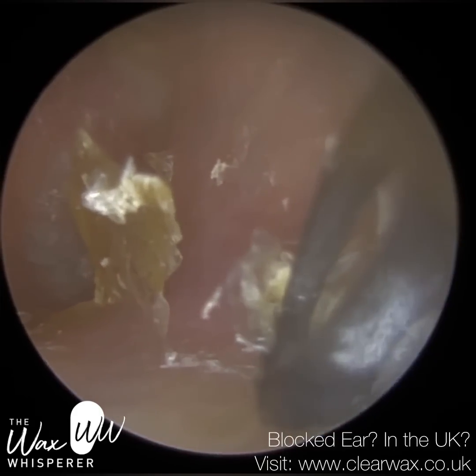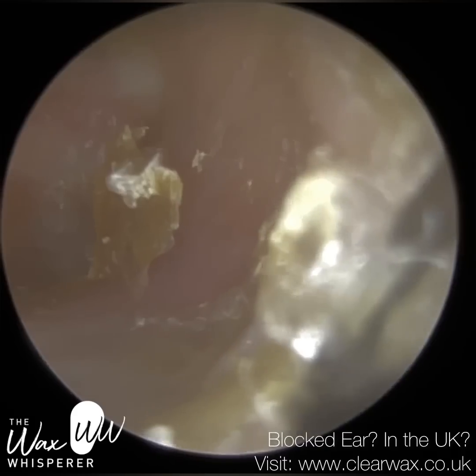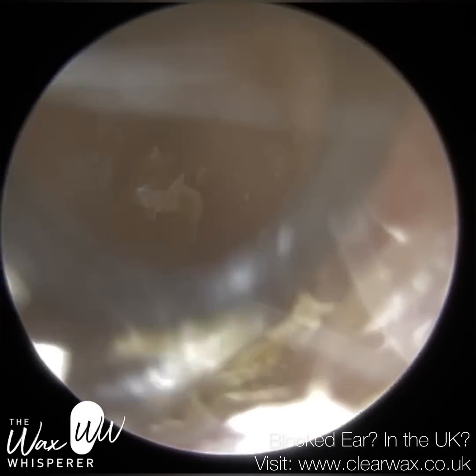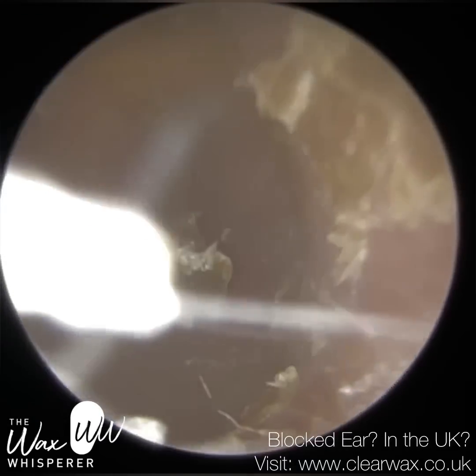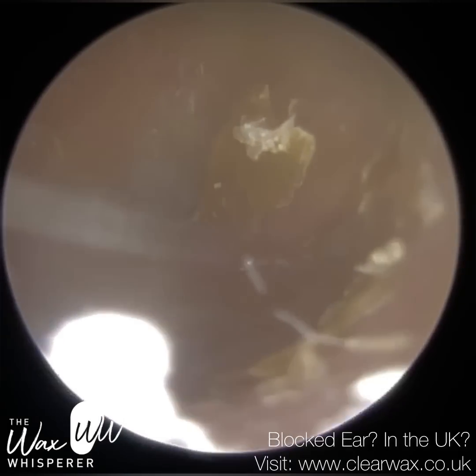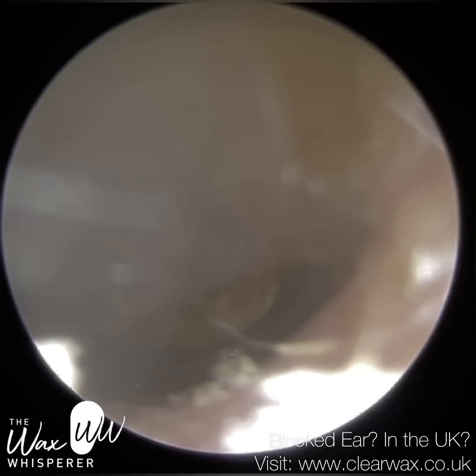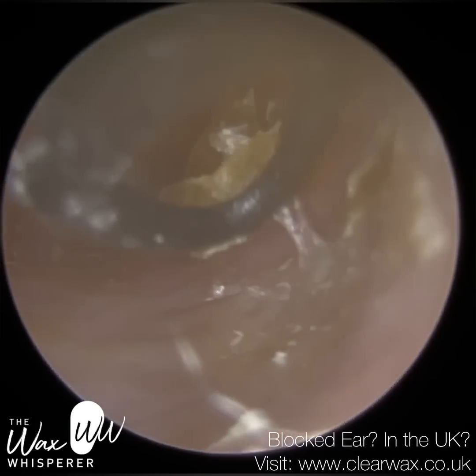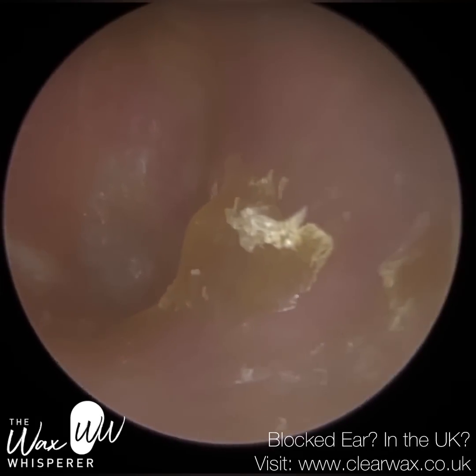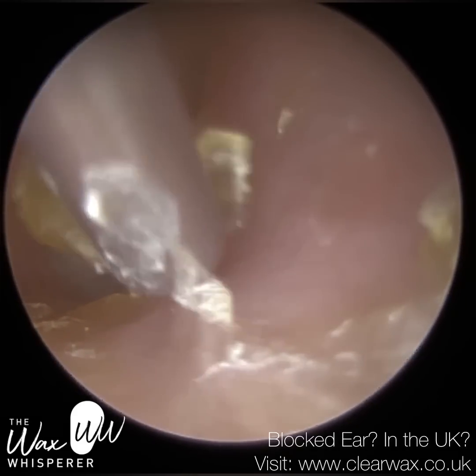So again, I'm just using the right Curette, just gliding, almost like a wallpaper stripper. That's the way it kind of looks on the screen, really. But we've got to be so careful because as you glide, you've still got to account for the curvature of the ear. So our ear canals have a slight incline upwards, about 30, the average is 32 degrees, but there's no such thing as averages in the ear. Everyone's ears are so unique. But as you're gliding, you've got to account for that upwards trajectory. So you've got to glide upwards. Otherwise, the tip of that Curette is going to bump against the canal wall and graze it.